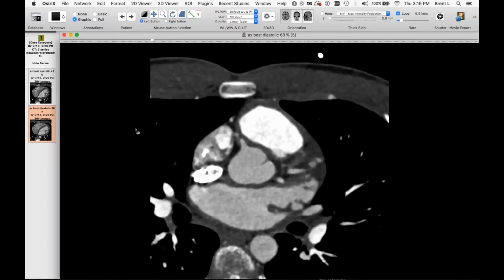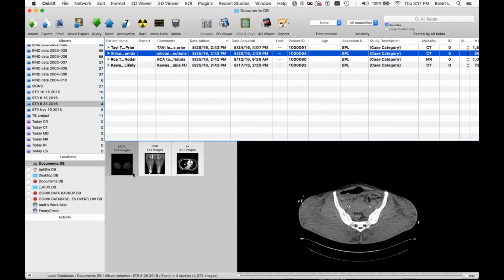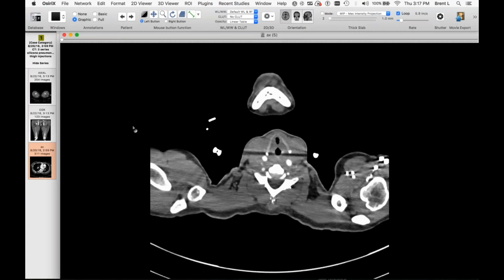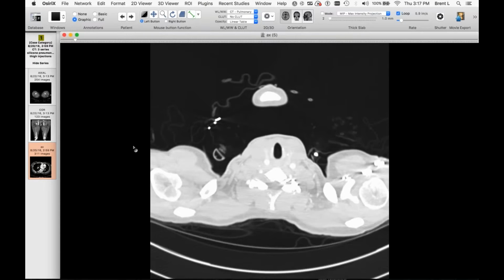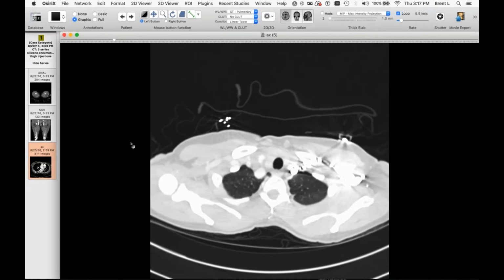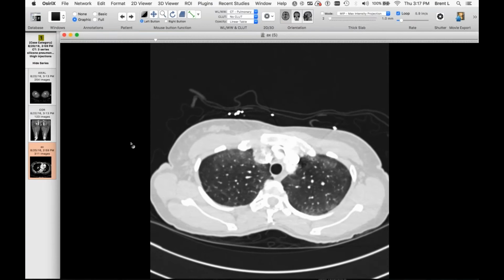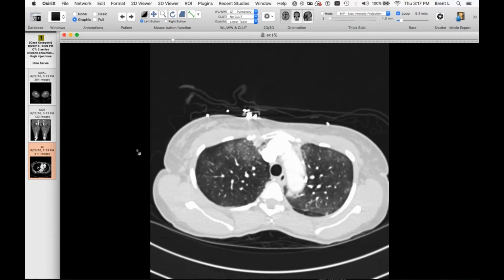Yeah, it's nice. And then one more. This is the most exciting one. Let me show you the chest CT first. This is a relatively young patient who came in actually with an arrest, and this is a chest CT that was done in the process of the workup. And I'll withhold some history for just a couple minutes from now.